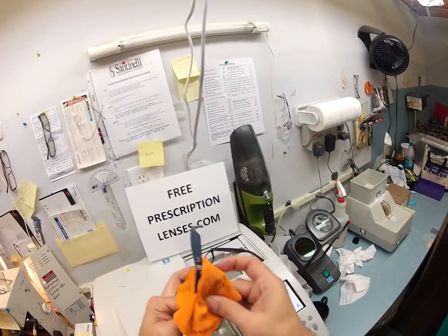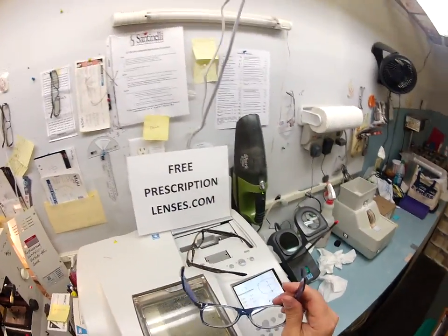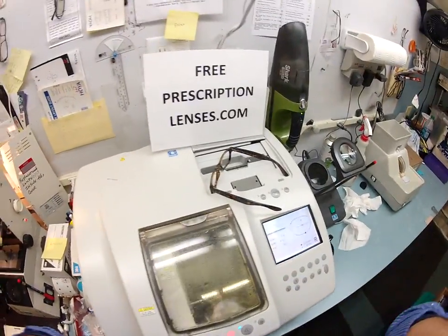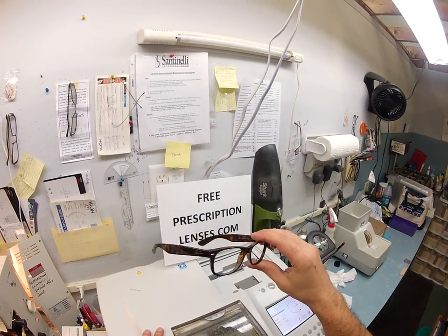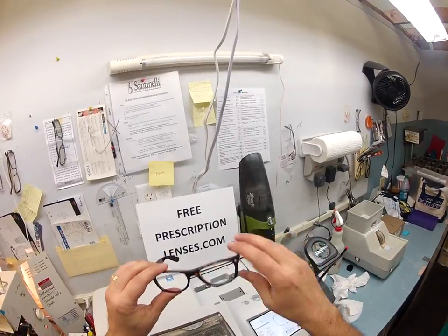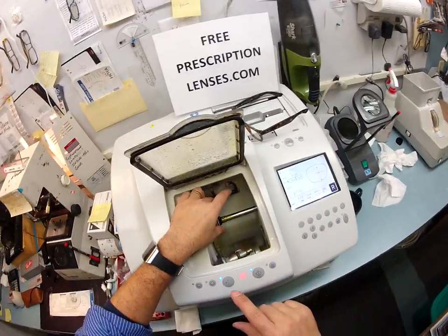Every case comes with a Ray-Ban cloth, and I'm going to throw in one of my own as well with instructions on how to care for it. Should you need any adjustments, 99% of all optical shops do free adjustments. If it's a little loose or a little tight, or if it's crooked on one side, just stop by your local place — it only takes about 30 seconds to adjust this frame.